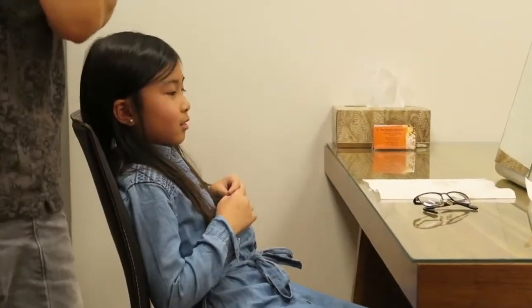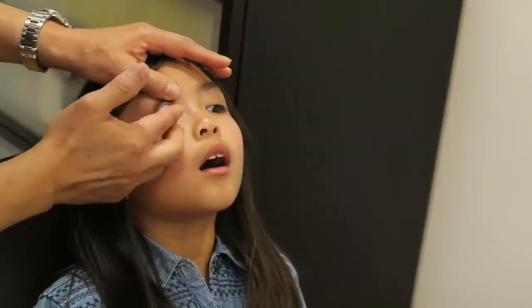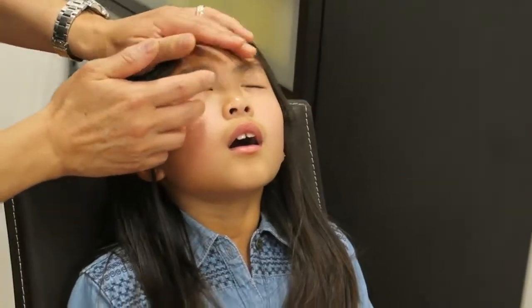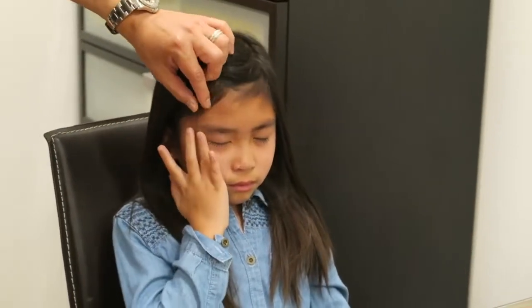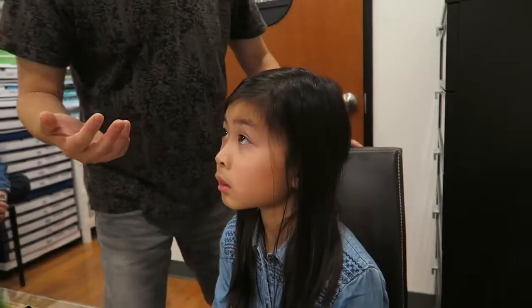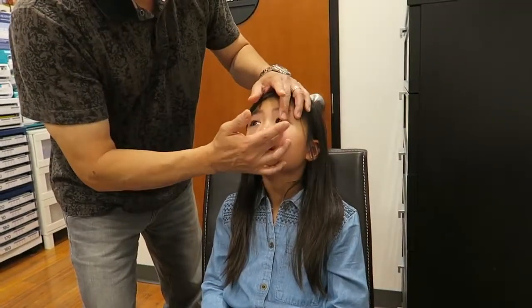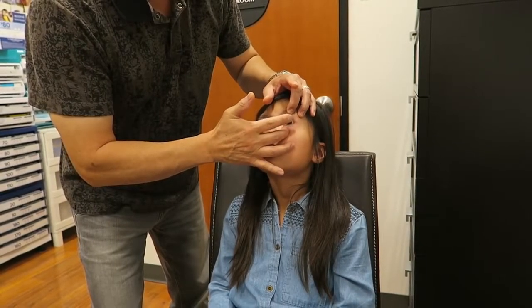All right, go ahead and sit back here. Just keep looking at the mirror. Look at me. Blink slowly, just like normal. Don't rub it hard like that — the lens is just in there. She's gonna feel it. Just look at the mirror, just like that.